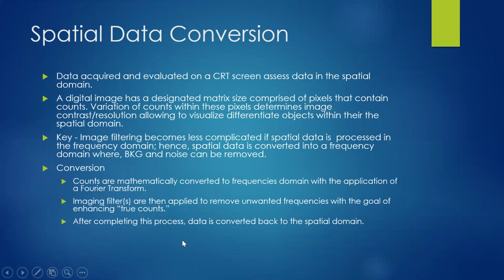So let's talk a little bit about spatial and frequency domain. Here comes another interesting point, critical in understanding the concepts of SPECT. Data is acquired and evaluated on our CRT screen to assess data in the spatial domain. So when you're looking at your two-dimensional images, whether it's a spot view, whole body view, or a lateral view of something, what you're really looking at is the spatial domain.